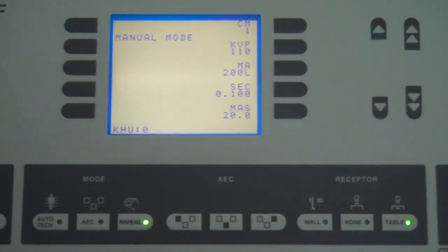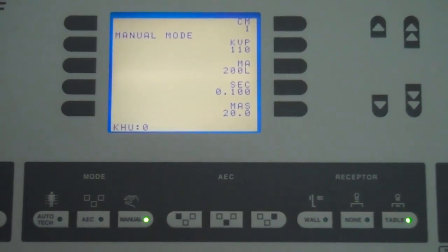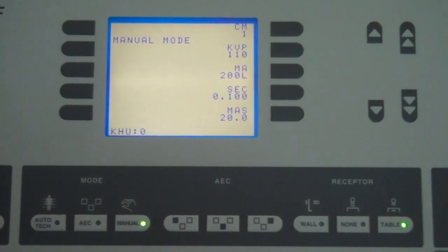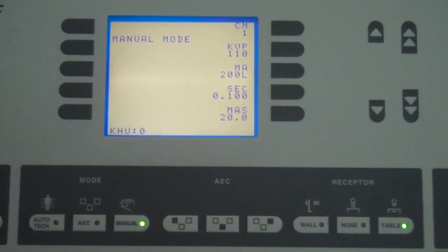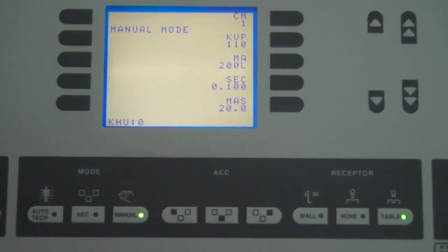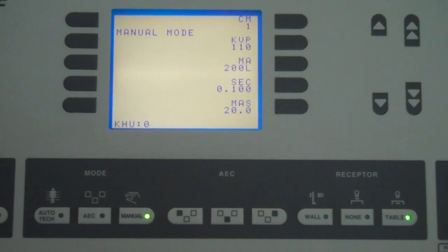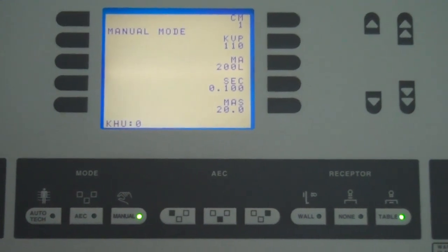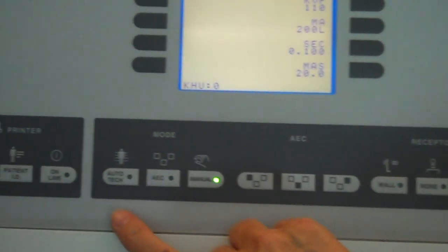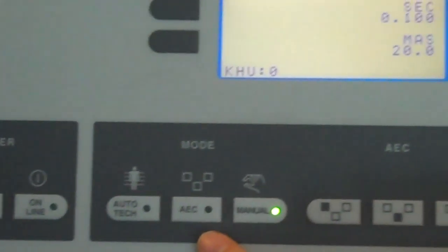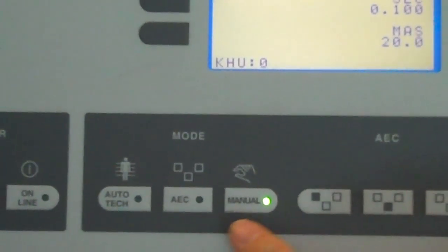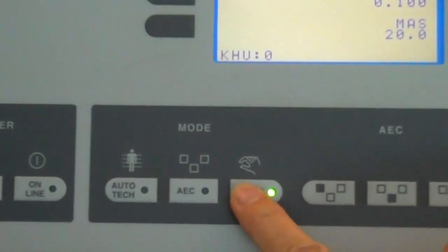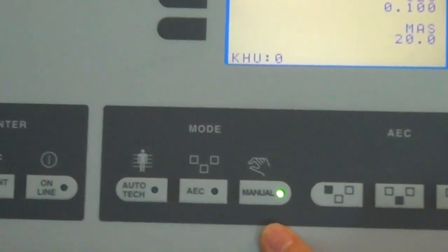We're at the control panel in Lab A. We've turned the main circuit breaker on in the control panel. To do the tube warm up, the next thing that we want to do is select manual mode. There is auto tech mode, AEC mode, and manual. Make sure that you select the manual mode.